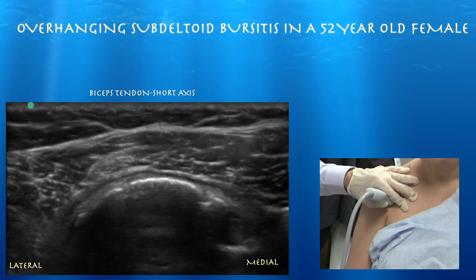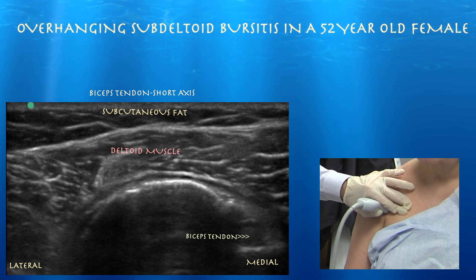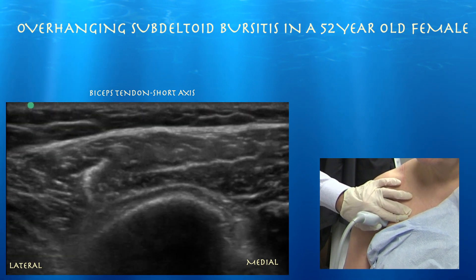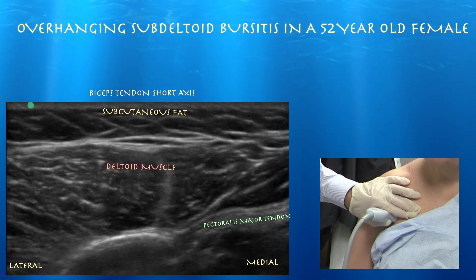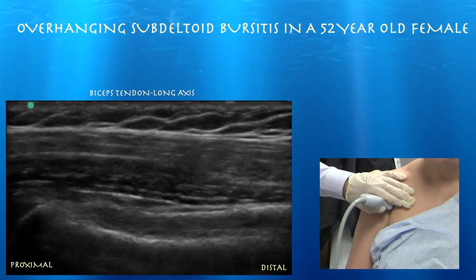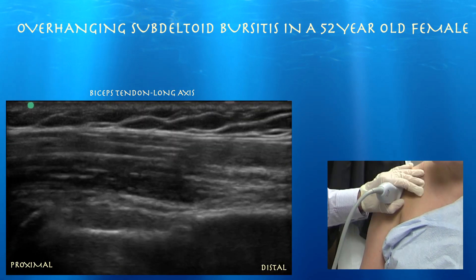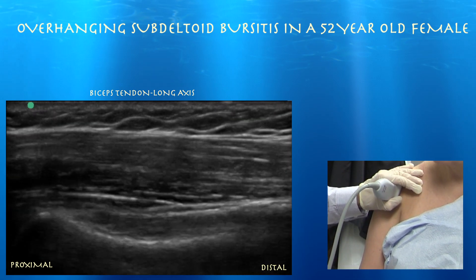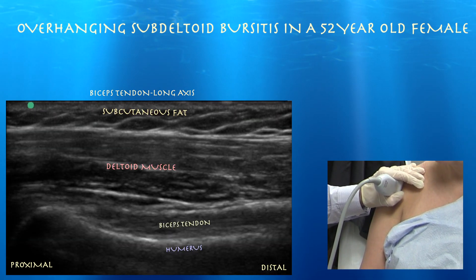We can see the biceps tendon — it's on the bottom right corner, not very clear, probably from anisotropy. Just following that along. You can also see the pec major tendon coming into play as you go distal. The right side of the screen is actually medial. She's thin and so she has a thin biceps tendon. Here's our biceps tendon in long axis.